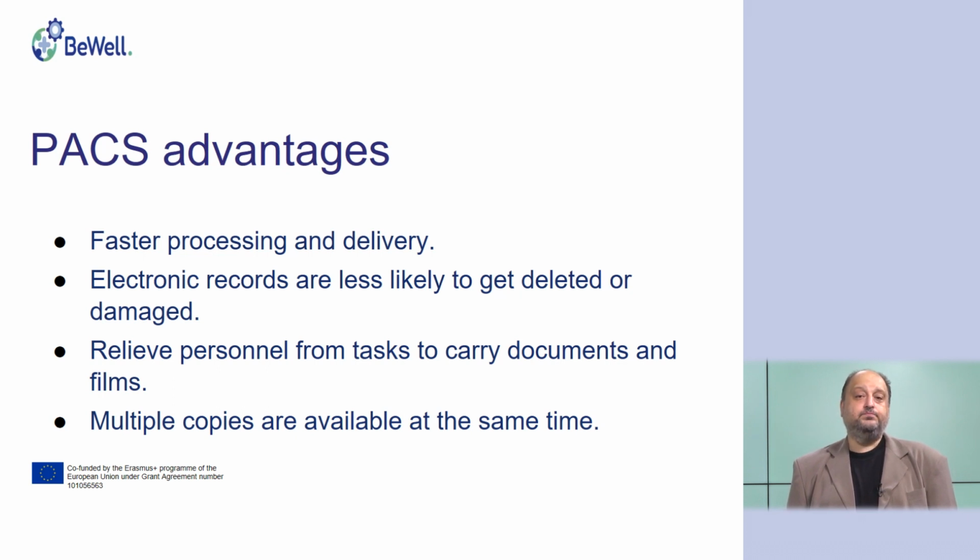And they relieve the personnel from the tasks of carrying the documents and films and searching for them. And this is very time-saving. Also, multiple copies can be available at the same time.